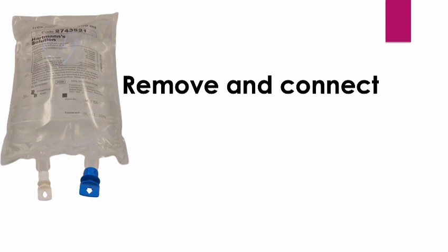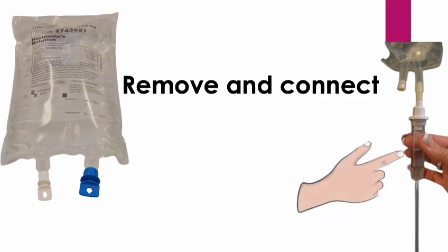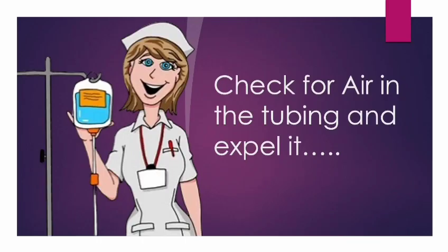When everything is corresponding, make sure that you remove the protective cover on the vacolitre bottle. Normally it's blue. This is to make sure that there is easy connection of the lines. Connect the chamber of the vacolitre without contaminating the drip. This is to prevent infection. Once you unclamp the vacolitre, make sure that you check for air in the tubing and expel it if present. This is to restore fluid balance.